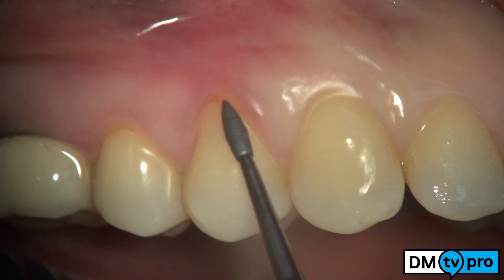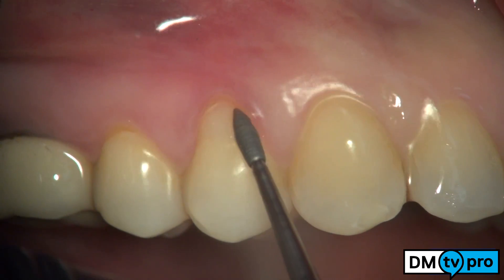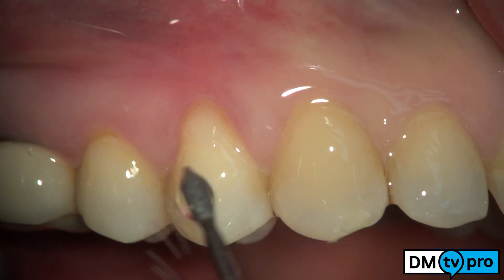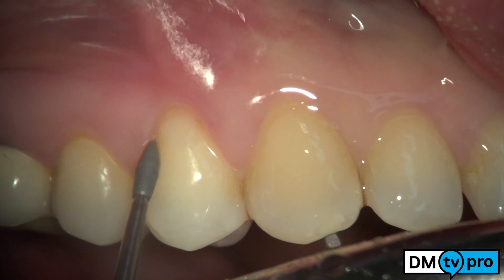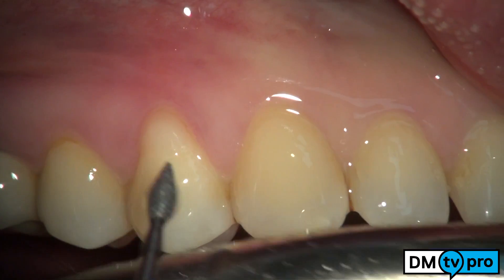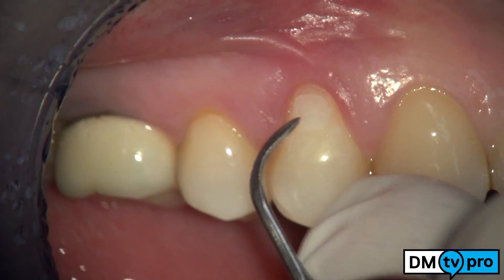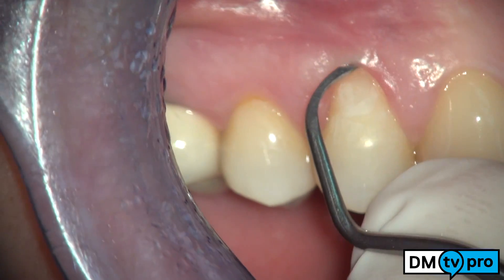Root preparation is performed with rotating instruments. A diamond burr is used on a slow speed handpiece. Then, with a m23 scaler, the root is planed in the sulcus.